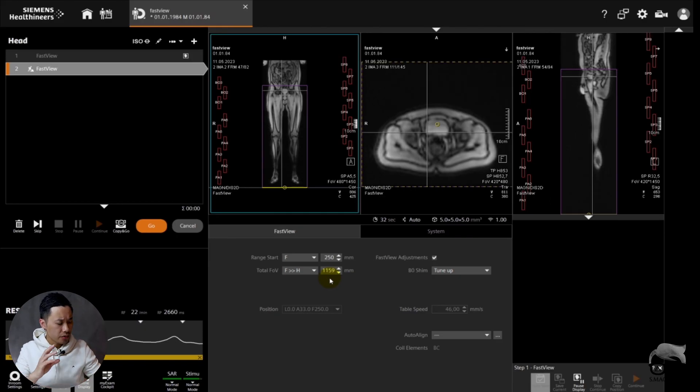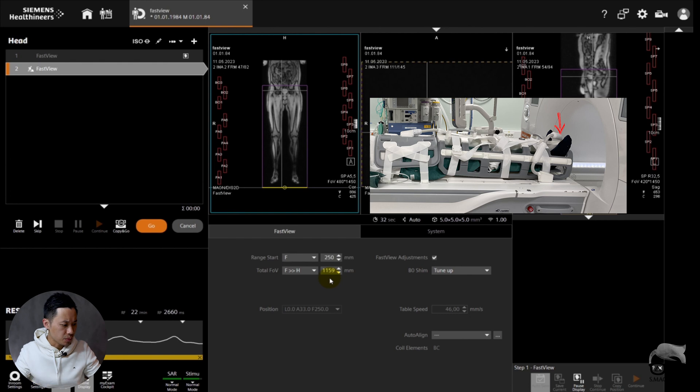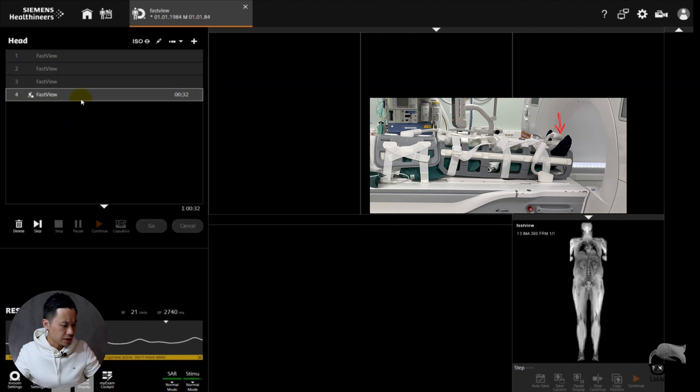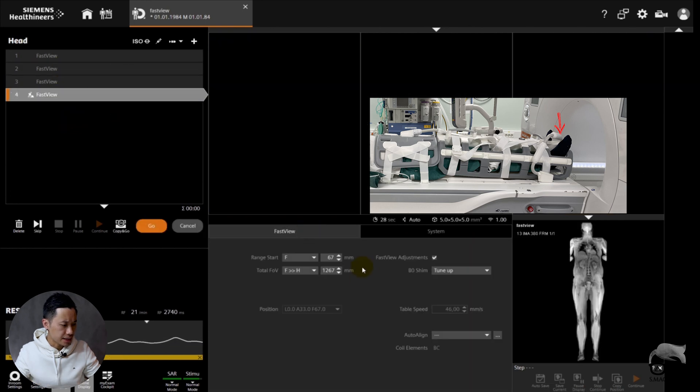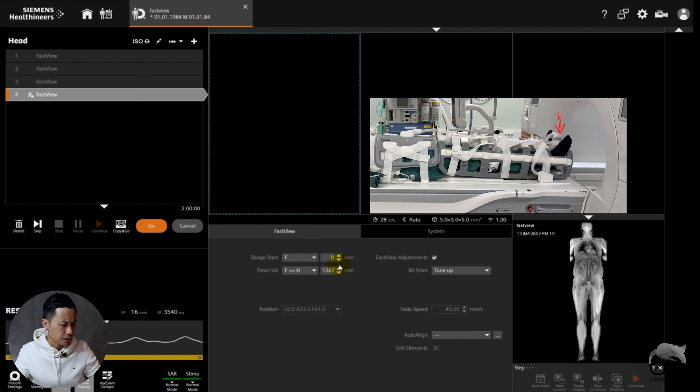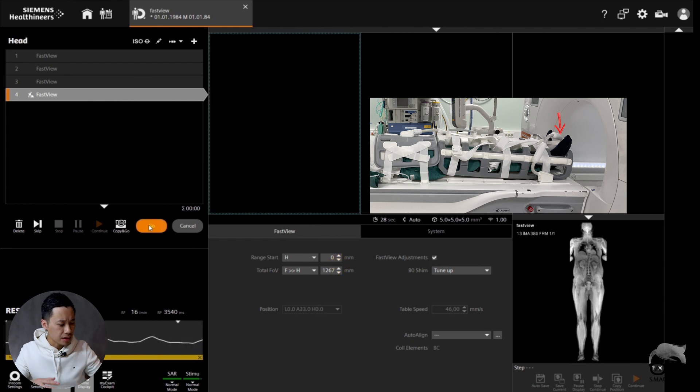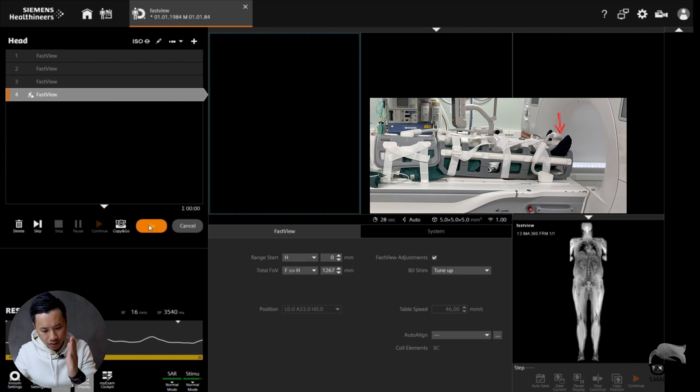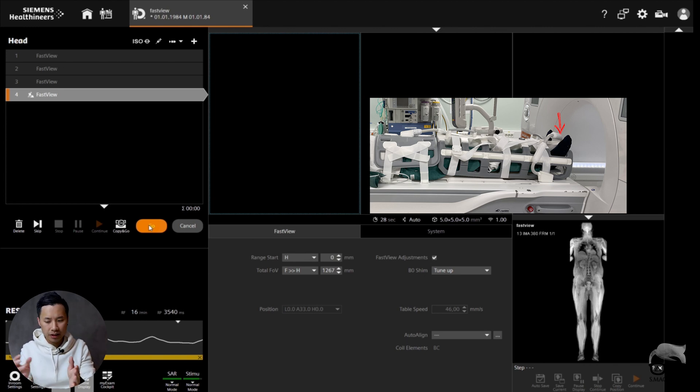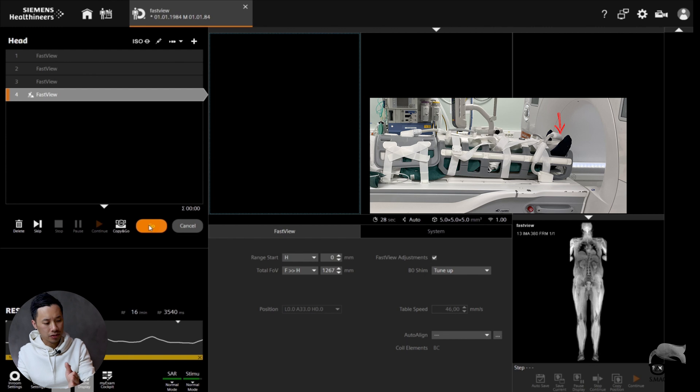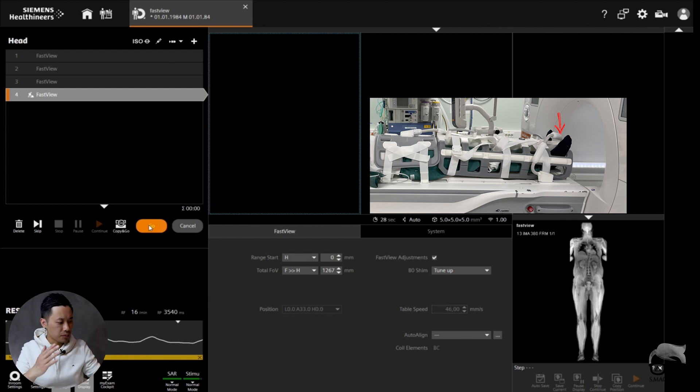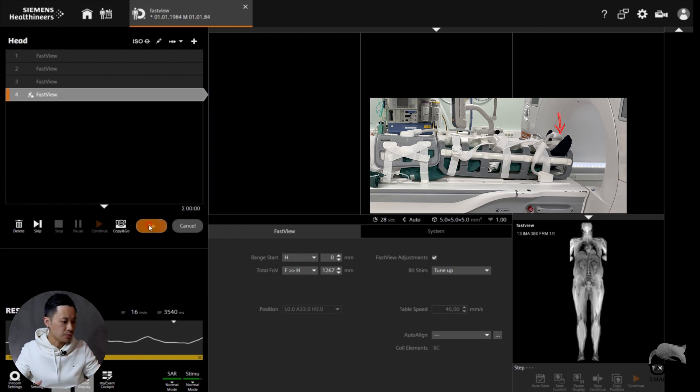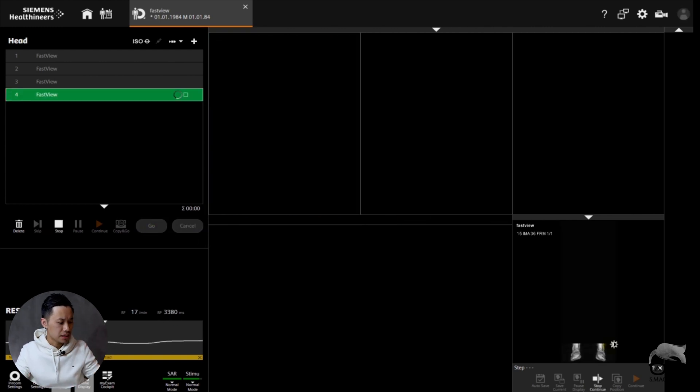Right now I want to reposition my ISO center and put the starting range at zero and let's see if it works. Let's put it at zero right there. You can see my ISO center is now at the feet. Whenever I'm positioning the patient, I want it to start exactly where I'm positioning. Let's see if it works.